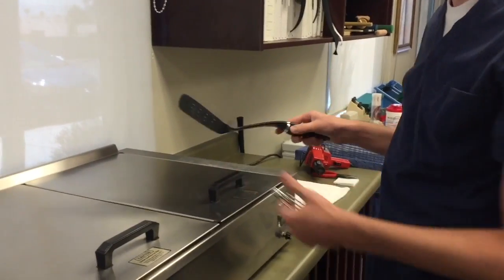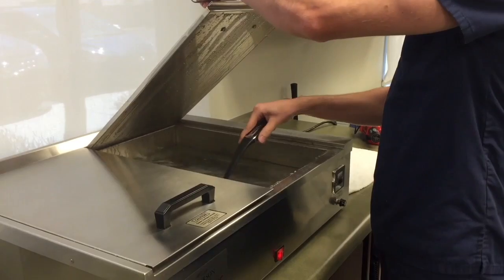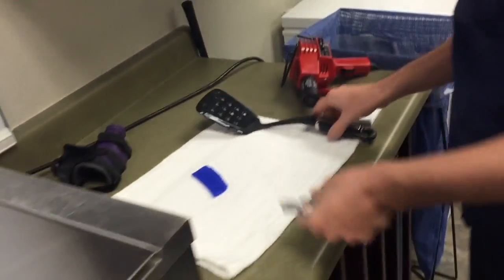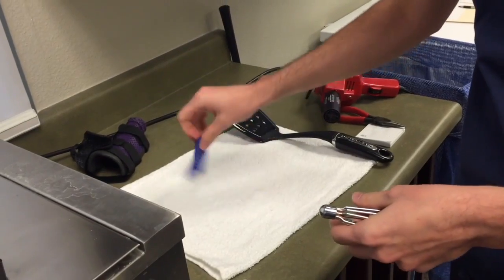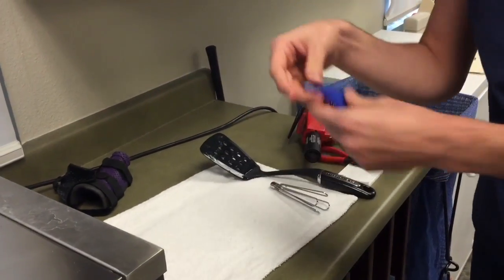This is a stack splint or tip protector. You just need the length of the finger. I'm not going to use this right now.